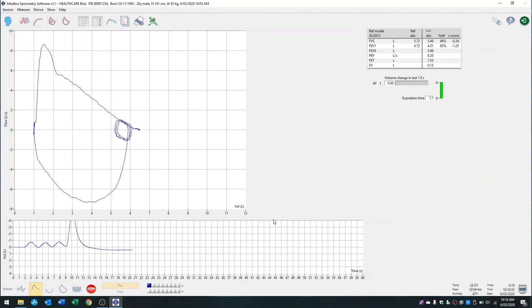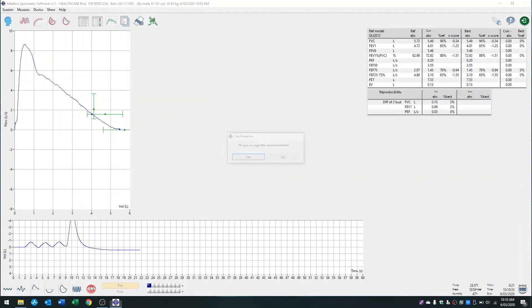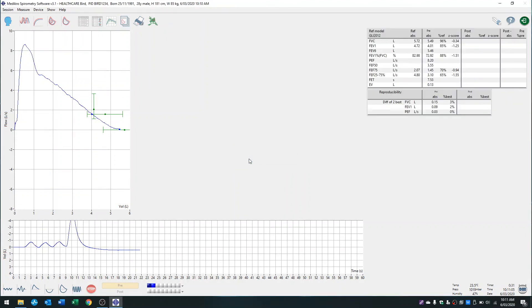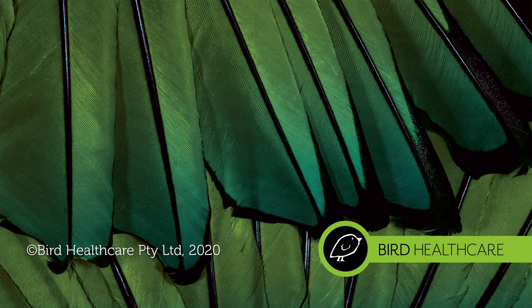All right, so I'll press stop. It will ask you if you want to accept this measurement. If it's satisfactory to you and within the acceptable limits, you would press yes.